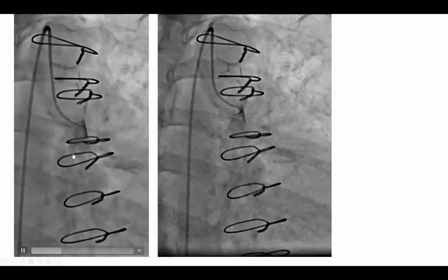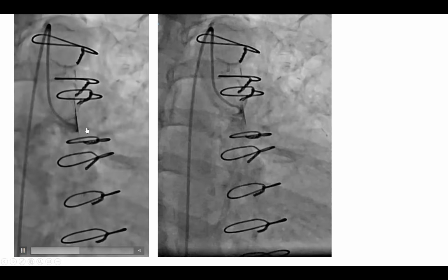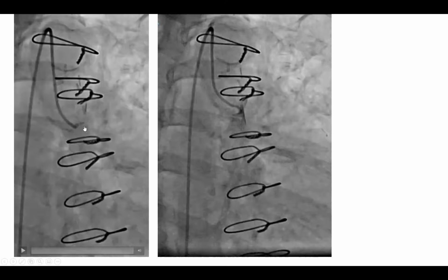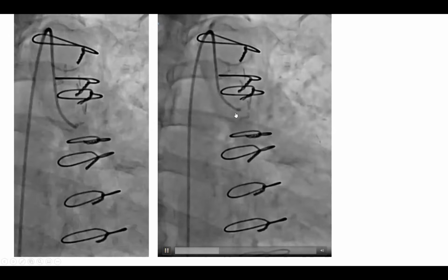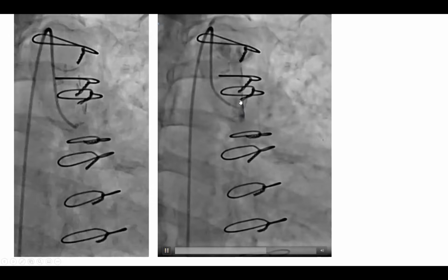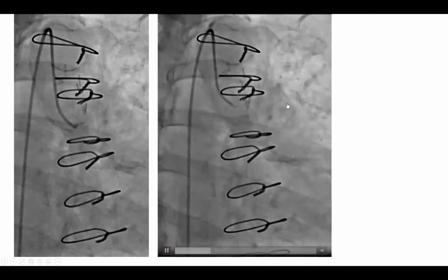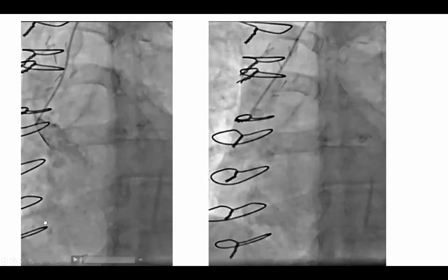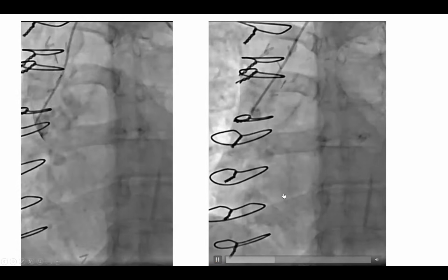Another thing is to do what I did here, is to pull back the catheter while injecting all across the aortic wall and to see whether there is an occlusion. And you can see here, we're pulling back and injecting to see whether we would see any graft. And we do that in two views. So I pull back with injections in two views. I find this more forgiving.